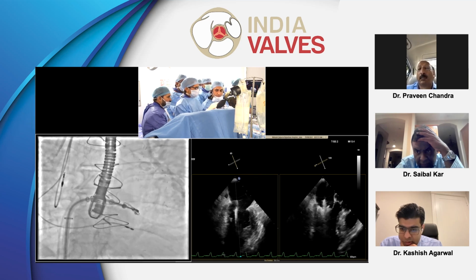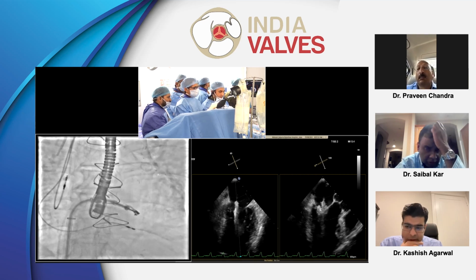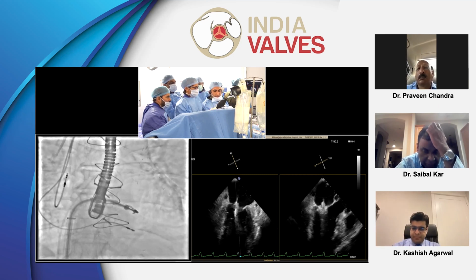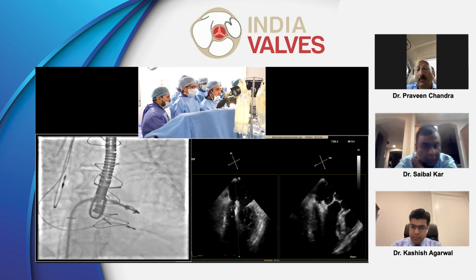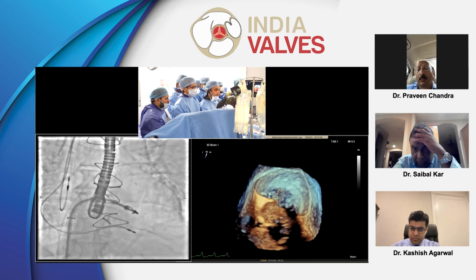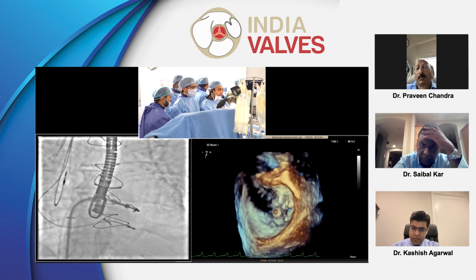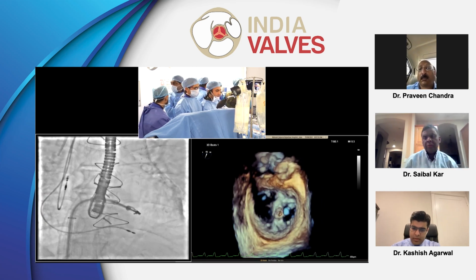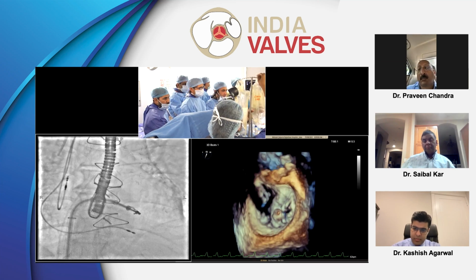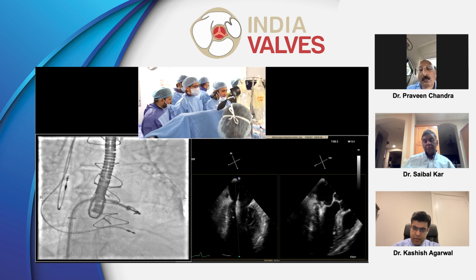Close it to 60. I would always see the orientation at this spot. I usually check orientation. Okay. That's it on 3D. Yeah. 3D and face. Drop the clip. That's okay. Now we wait. Let's check the orientation. Yeah, so don't close the clip. The posterior may have come out. Yeah, the clip is completely rotated wrong. Let's look at the orientation, Prashant. I think, no, we're about 11.5. Yeah, 11.5. Yes.